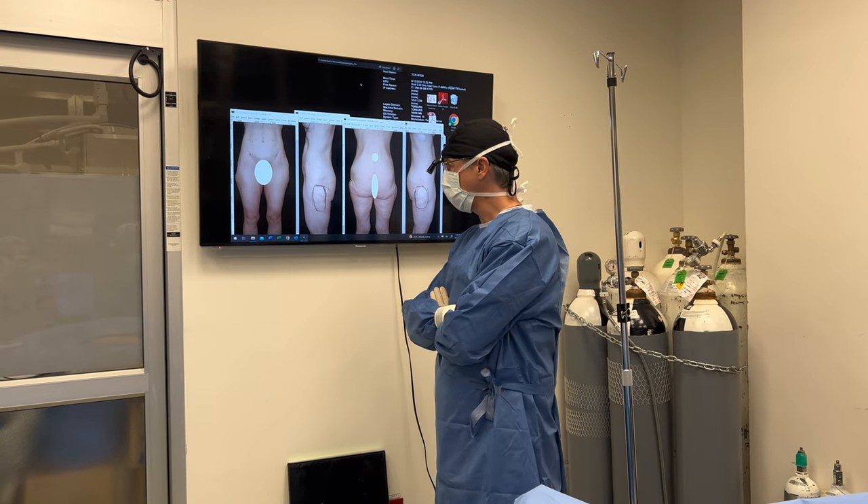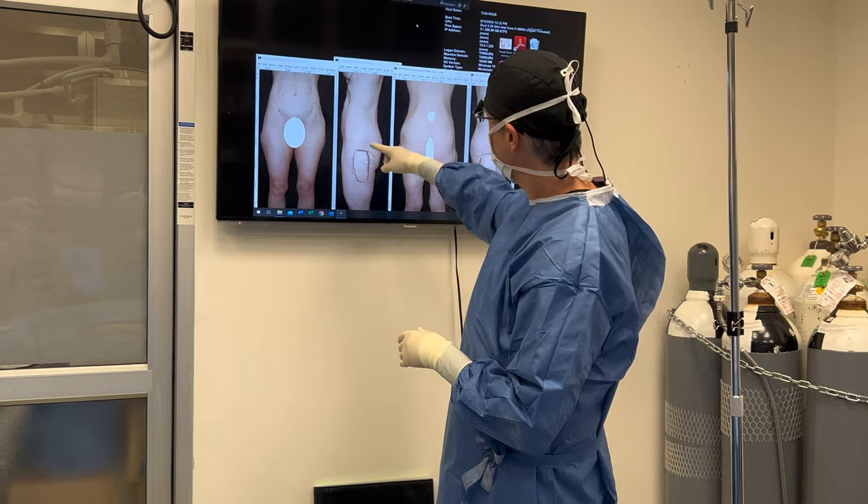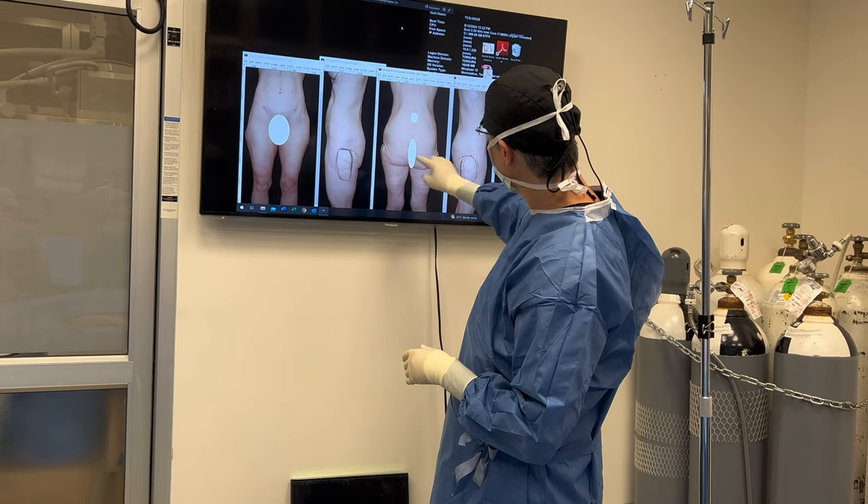Up next we will be doing a little lipo for saddlebags. The same lady has lost a lot of weight and has loose skin. Look at this area here — you can see it bulging out: saddlebags.